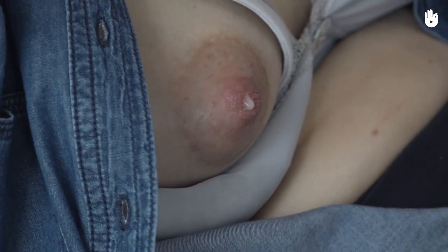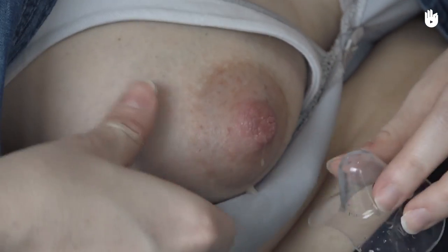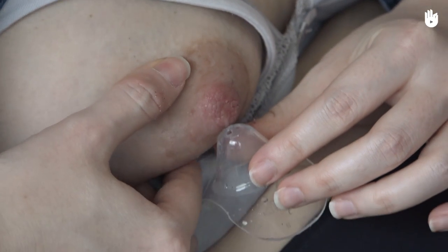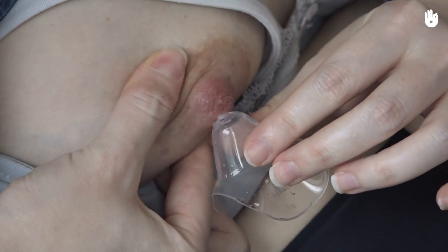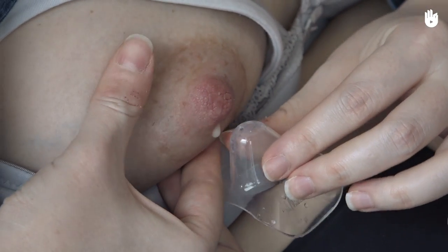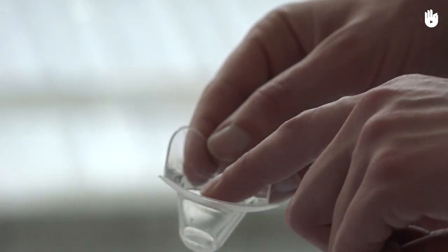To fit the nipple shield, express a bit of milk and apply it to the shield. The smell of the milk will cover that of the plastic to encourage the baby to try and latch onto the nipple shield. Moisten the edge in contact with the breast to facilitate sticking. Make sure the nipple is well centred.